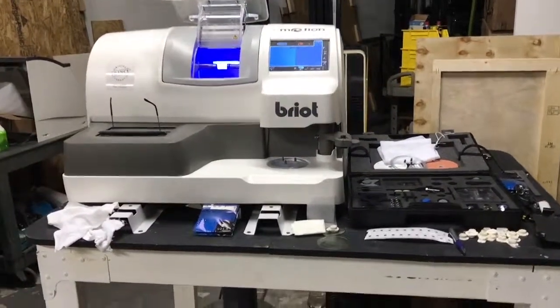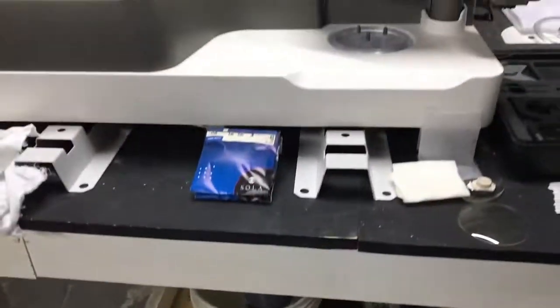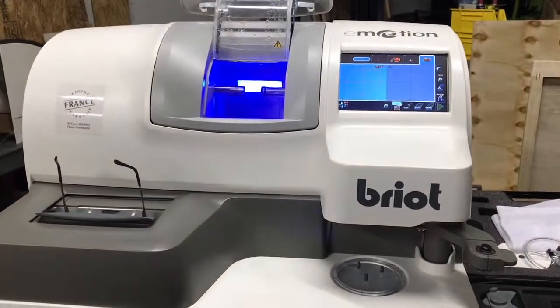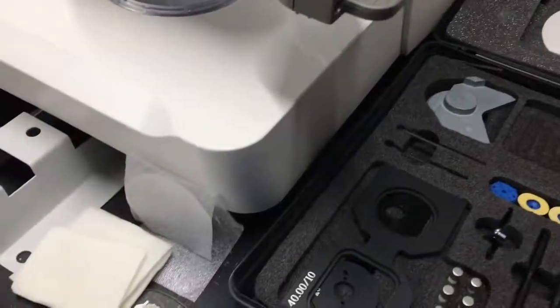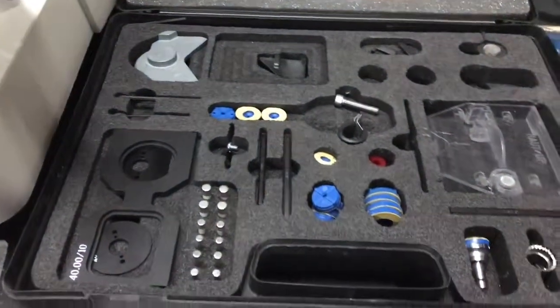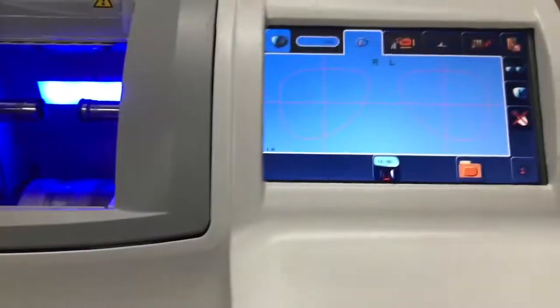This is the Briot Emotion. It comes with the bucket, water pump, and all the accessories — it's a 2015, great condition. This is for putting the pump inside. This is a very good filter. This you will replace in case you need a smaller lens. And these are all the calibration tools — it's already calibrated.